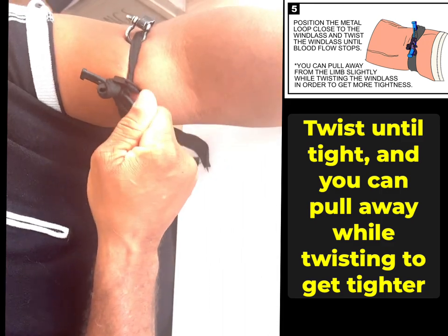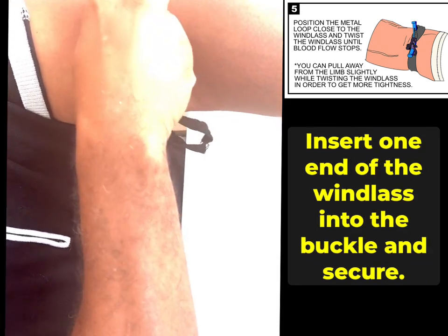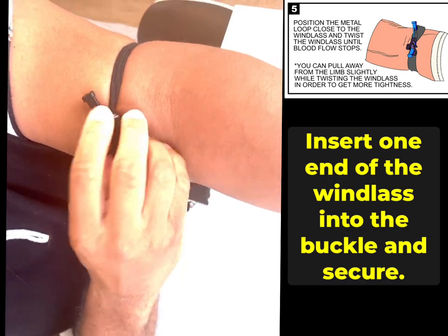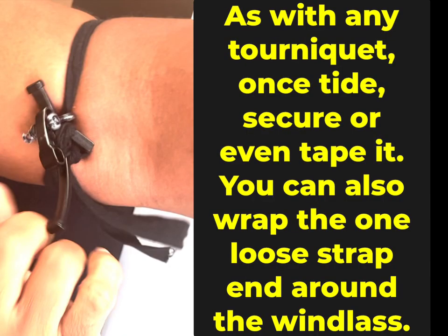After you've tucked one, you take this, just twist, and slide this right over it. This is a locked tourniquet — that's the whole process.